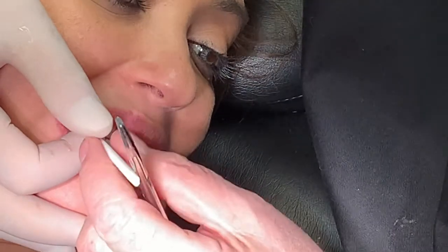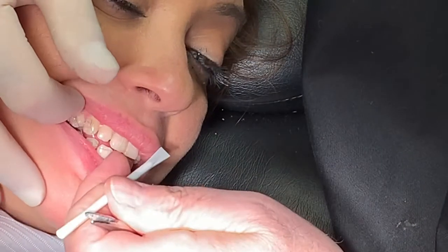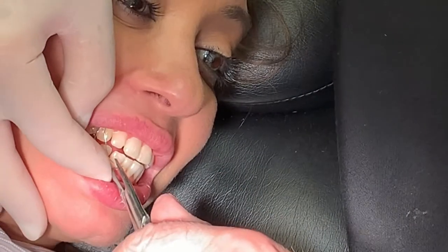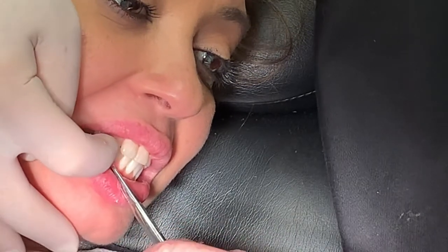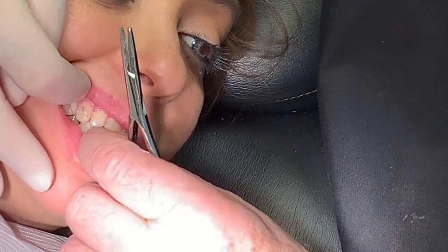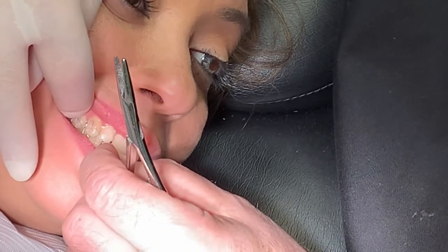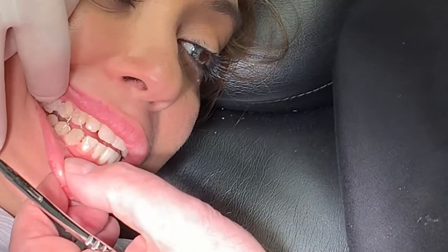There you are. Now, you might decide that's perfect, or you might decide it's too loose, but you have to make that decision. So it looks to me that it might be just about right, but I feel like I want to take up more slack. So, again, now I'm taking up slack. Holding the wire, make the pigtail shorter and shorter, and then you look at your mouth and look at the motion. Look at how loose or tight. If it's too tight and you can't speak, move your jaw a little bit around and examine. See what I mean? That's good.